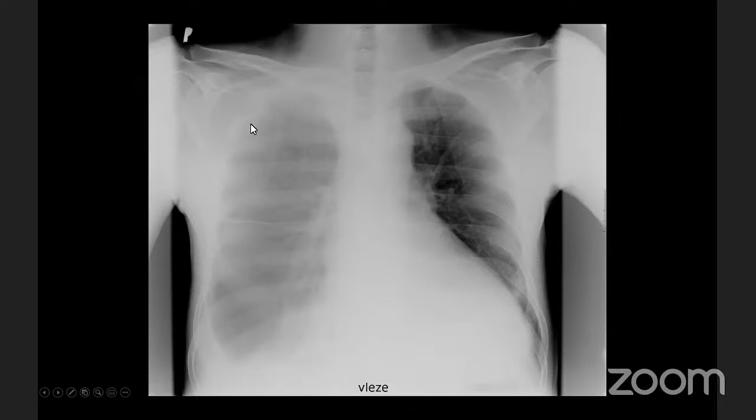In a lying patient, this is the difference that lets me tell you this is not a pneumonia of the lung, because you see the lung markings. The lung markings are similar on both sides. Just on this side, it's more hazy. The whole hemithorax is covered with something, and that's because there is fluid behind the lung. You can see this is the interlobar fissure, which is in normal position, which is great. And if it's enlarged, thickened, that's usual with fluidothorax.